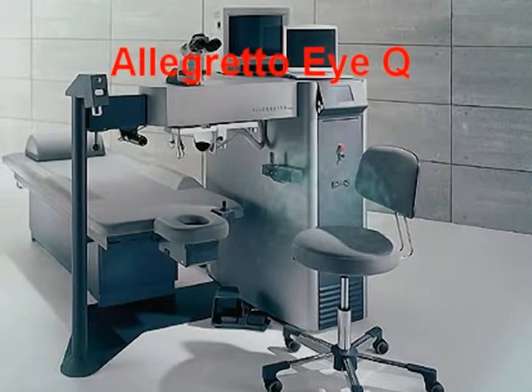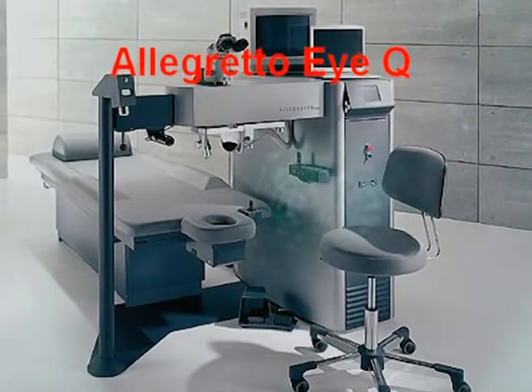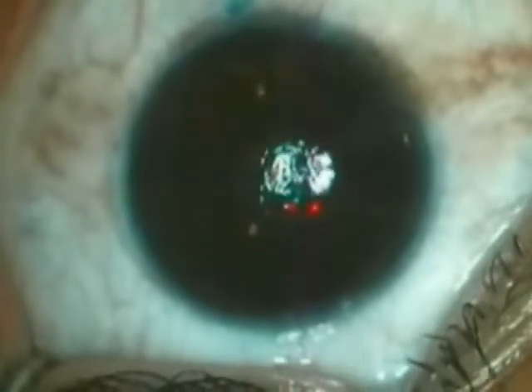as advanced surface ablation. Epithelial scrape with the excimer laser in the PTK mode is critical since epithelial thickness is not regular in these cases, and we need to reproduce the same stromal surface as was measured preoperatively with the intact epithelium. A large ablation diameter is critical, such as in the Allegretto IQ platform, which goes up to 9.8 mm in diameter. PTK is also applied with a smoothing agent, such as diluted Healon, artificial tears, or even BSS.